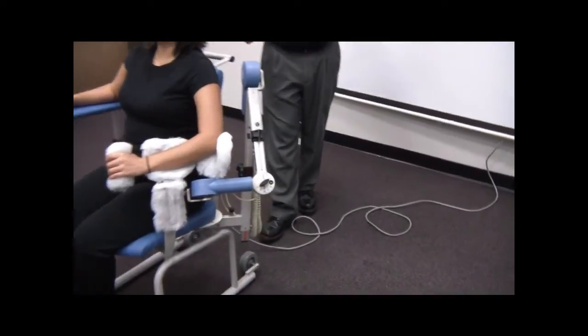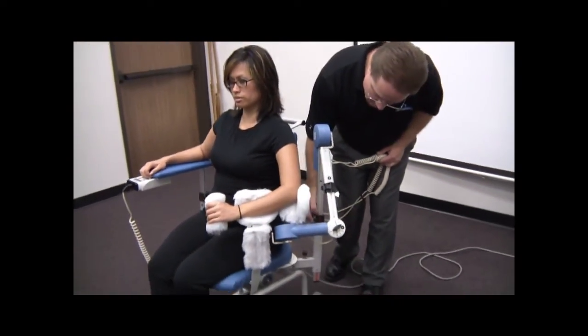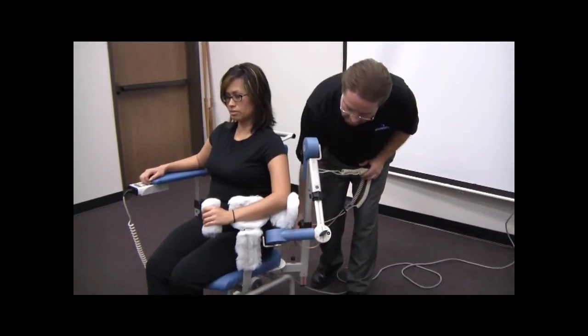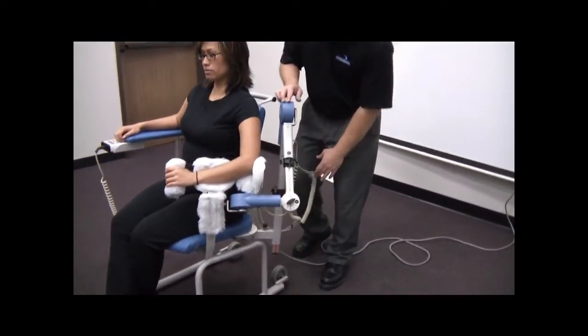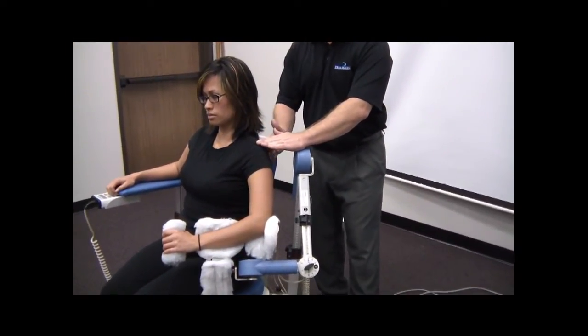Some techs will make a note of this setting so that if the patient has a kid or they, in moving it, get that out of adjustment, they'll note it somewhere so that way they remember that this particular patient, Ann, was a 30 on the number 2 setting. Okay, so we've got the number 1 setting, which is pretty standard. We just set the number 2 setting to Ann's height, okay, to line up with her shoulder joint.